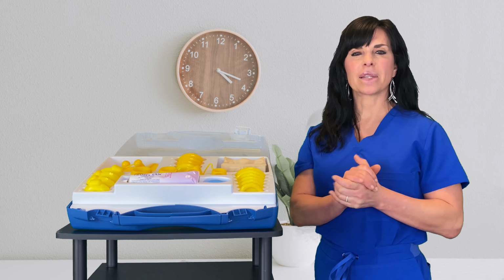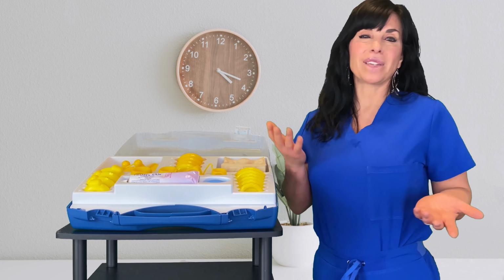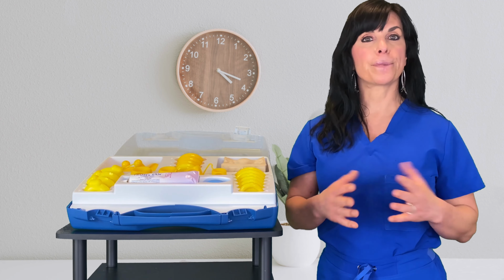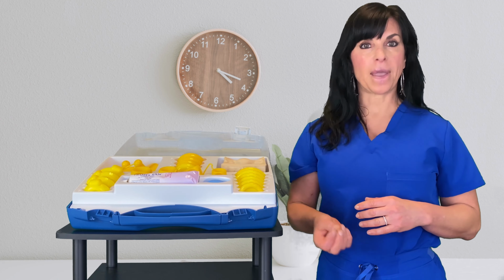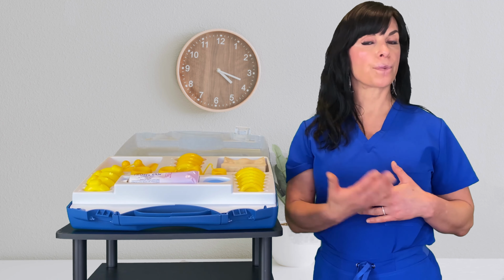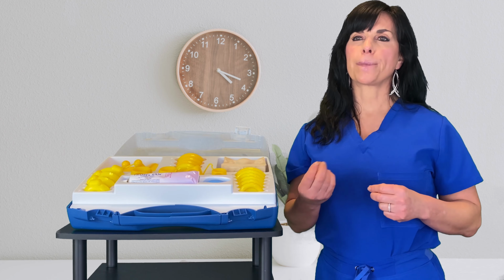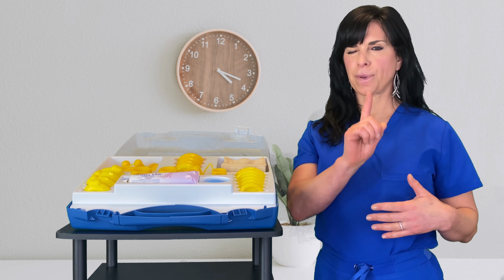So the main thing is women, I guess, just fear of having this foreign object in their vaginas, but it's kind of like having a tampon in there, or a diaphragm, or a contraceptive ring, or even a hormone therapy ring. So it really should not cause any damage, pain, or worsening conditions. We also give you instructions on what things you should look for that would be of concern, or also try to keep you from getting an infection or any kind of ulcers in the vagina, and I'll explain that shortly.